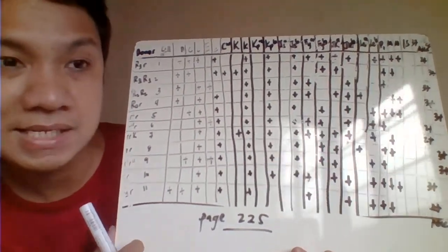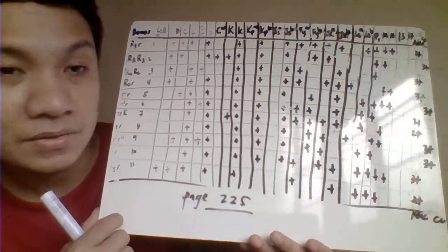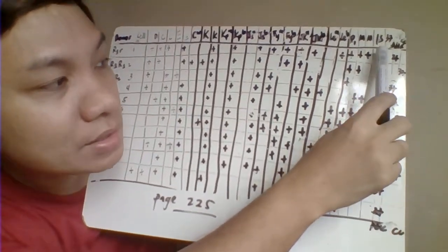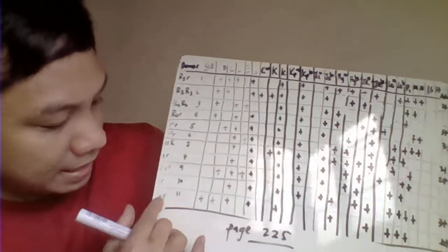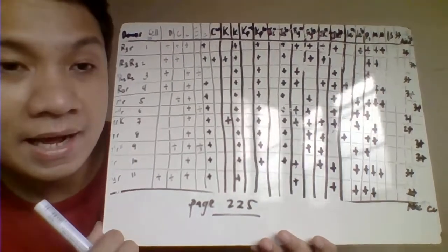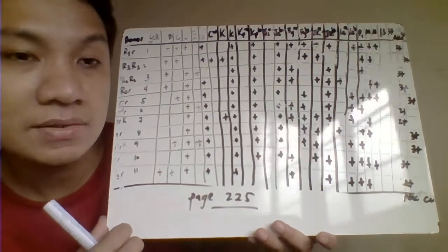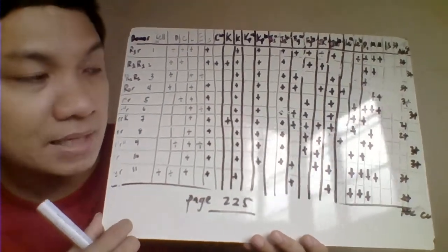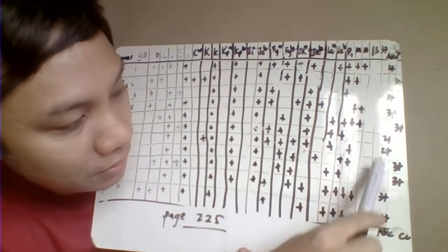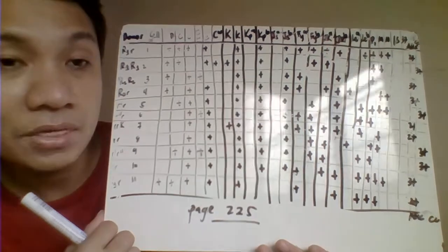Auto control here is the patient's own red cell. So you add it to their own antibody, as your serum sample containing its own antibody. Notice here in the IS, or immediate spin, all of your 11 panel cells have a negative result, signifying that our antibody is not IgM. If you are positive in the immediate spin phase, that would identify the presence of IgM antibodies. At 37 degrees incubation, all are also negative. We have no reaction, signifying that our antibodies are not reacting at 37.